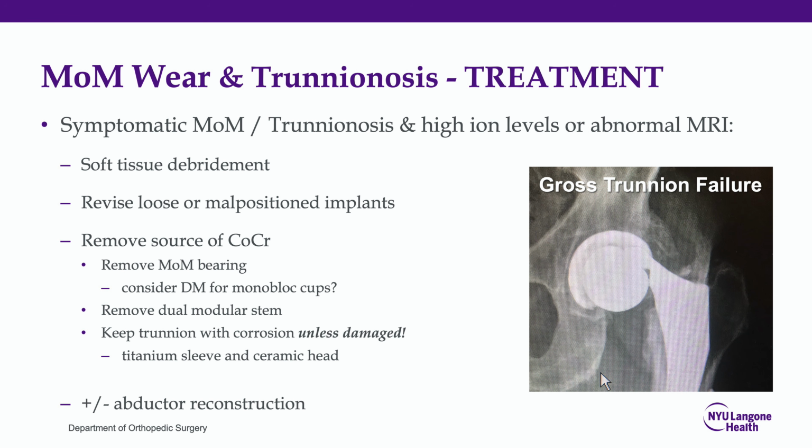In the case where you had a large diameter metal-on-metal bearing with a resurfacing style acetabular shell, there are case series reporting good outcomes by just revising the femoral side and using a dual mobility construct, putting the new large polyethylene articular bearing against the retained monoblock shell.